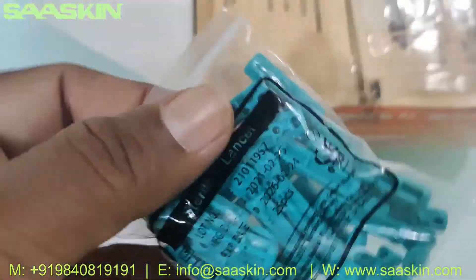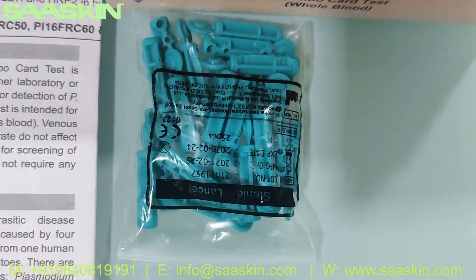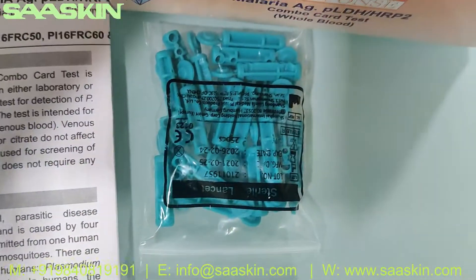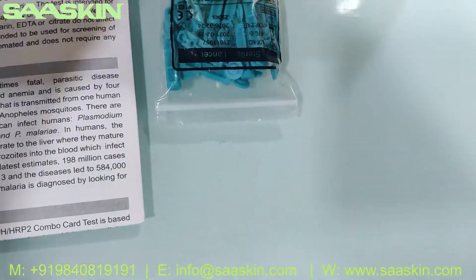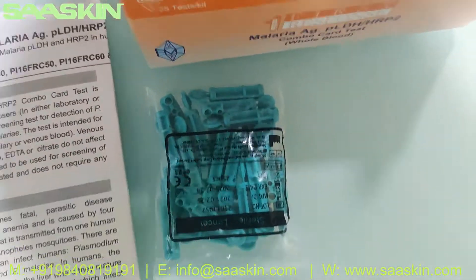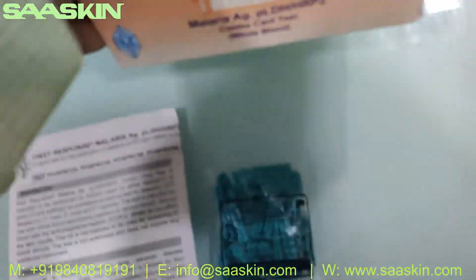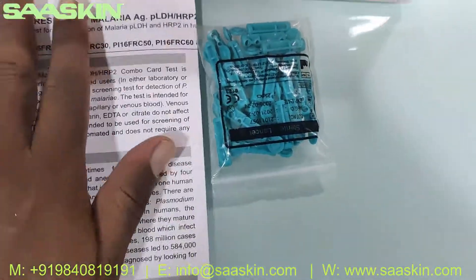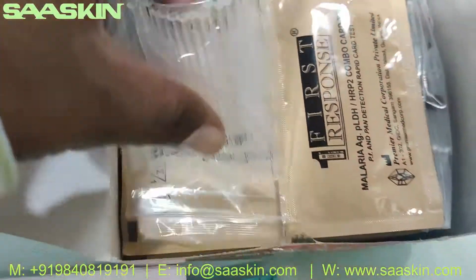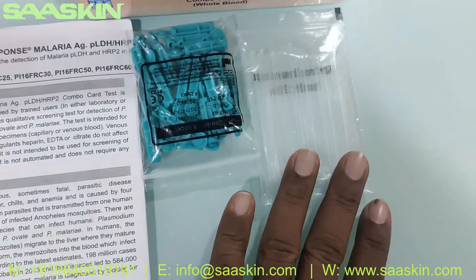Inside the box you will find the lancers — this is a 25-test kit so you have 25 lancers. And you can also see 25 specimen transfer devices.